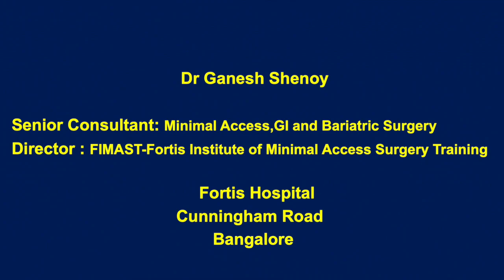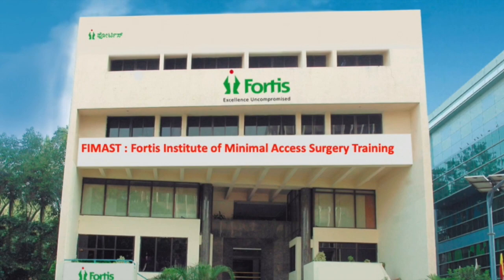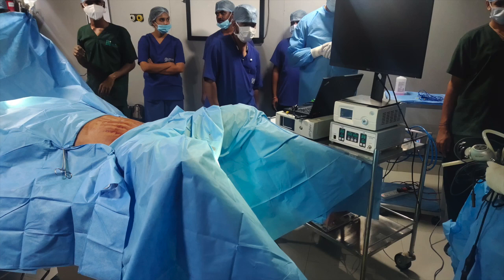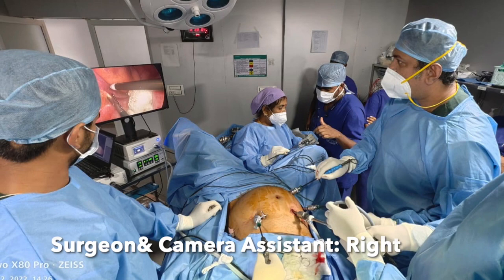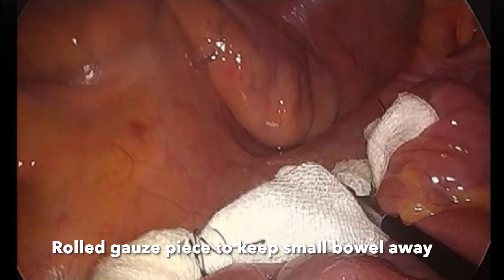This is a video demonstrating the steps of laparoscopic posterior mesh rectopexy for a patient with complete rectal prolapse. The patient was placed in a low lithotomy position with the monitor on the left side near the foot end. The surgeon and the camera assistant stand on the right side of the patient, and the assistant surgeon stands on the left side.